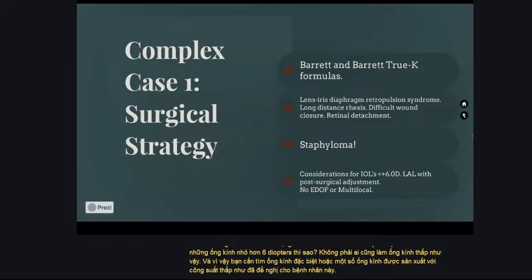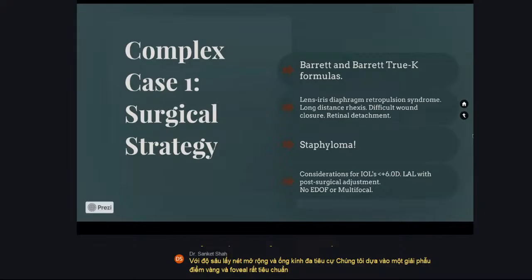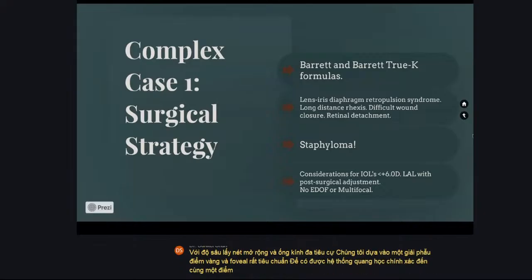With the extended depth of focus lenses and the multifocal lenses, we rely on a very standardized macula and foveal anatomy to get the precise optics to come to the same point on the fovea and give the patient that extended range.